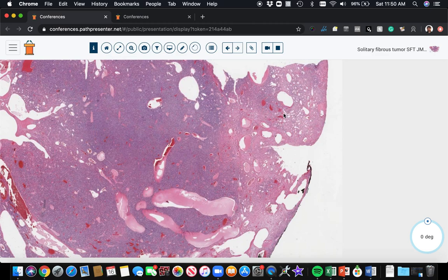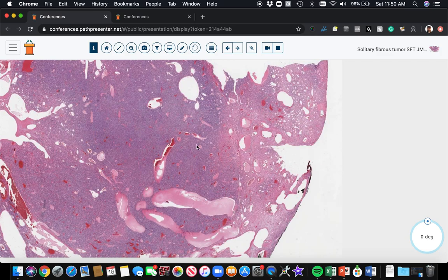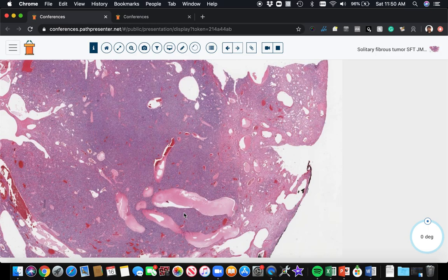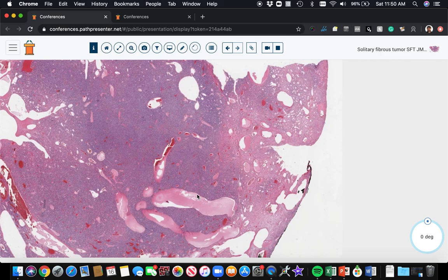So that range of cellular with hypocellular sclerotic zones and the presence of dilated vessels from low power - we haven't even gone in close yet - but from low power, those things should make you think of solitary fibrous tumor.